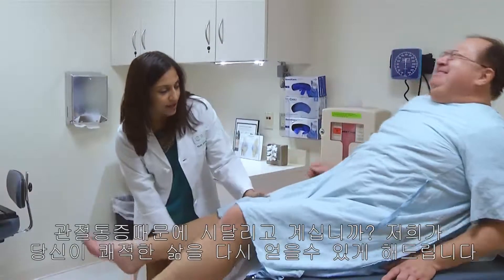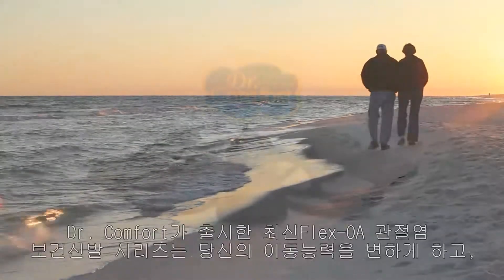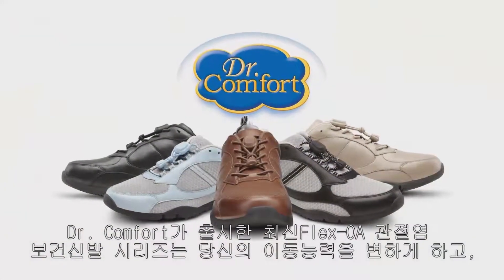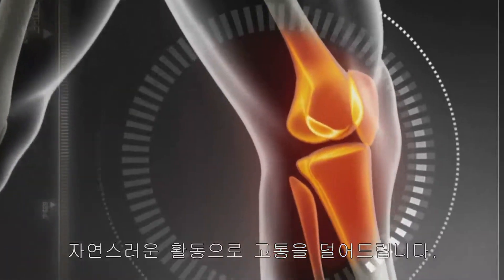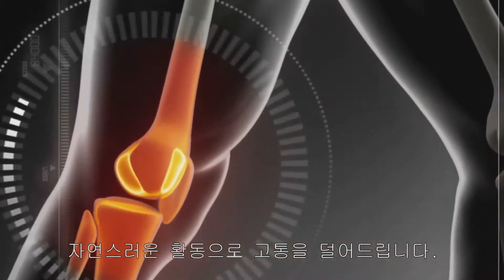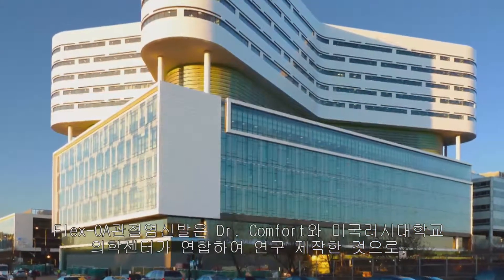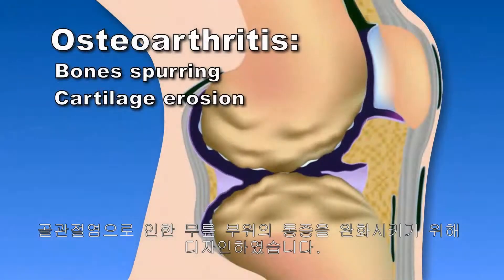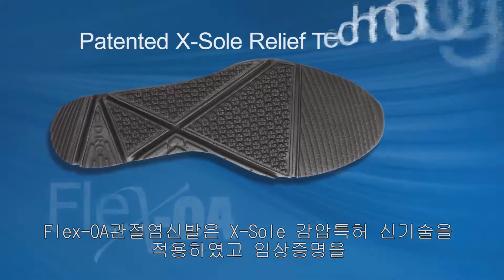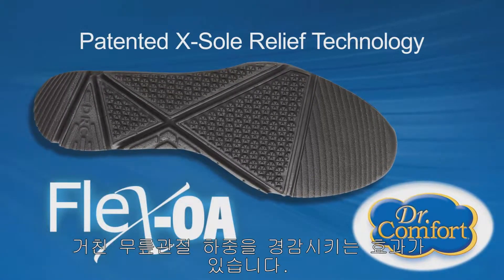Do you suffer from knee pain? Imagine walking through life in comfort again. The new Flex OA Comfort Footwear Collection from Dr. Comfort can help change the way you move and let your natural foot motion reduce your pain. Created in association with Rush University Medical Center, Flex OA was designed specifically to reduce knee pain associated with osteoarthritis, or OA. Flex OA uses patented X-Sole relief technology, proven to reduce the load on your knees.